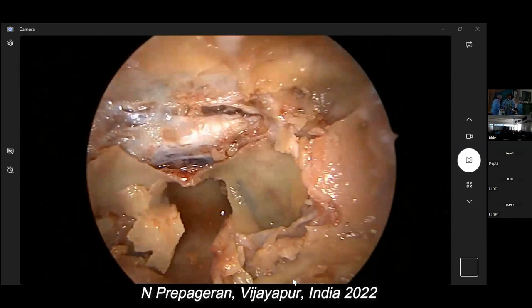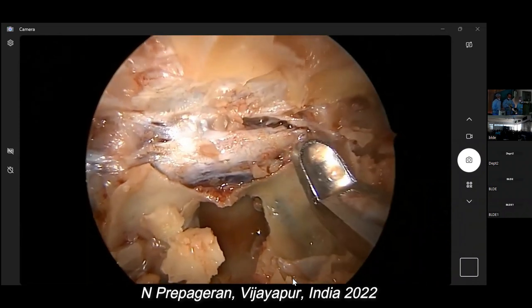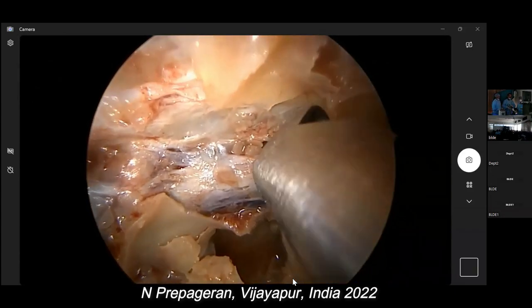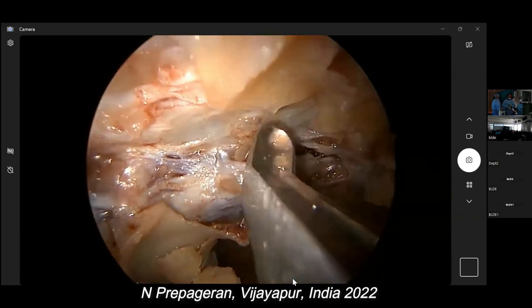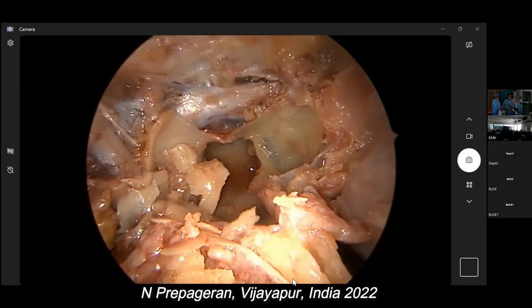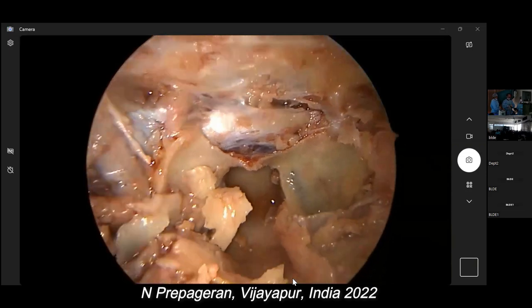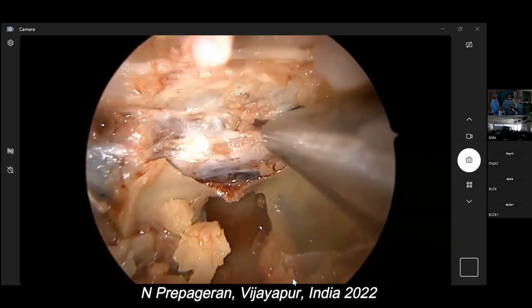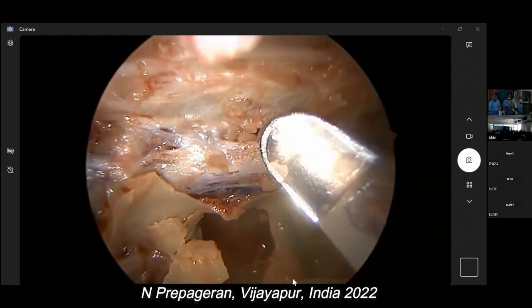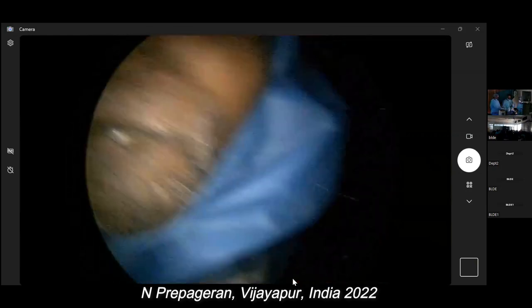So one long movement. See, if you accidentally bang like that, your scope is gone. So when you do this, always keep your scope far away. Very, very important, yeah? I've seen it happen in enough dissections, even by the world's best people, in live dissections everywhere. It has happened to me once before with the old scope. As I was pulling out, the bone became loose and hit my scope. So it can happen even to experienced surgeons. And that goes, 2 lakhs, is it? Okay.